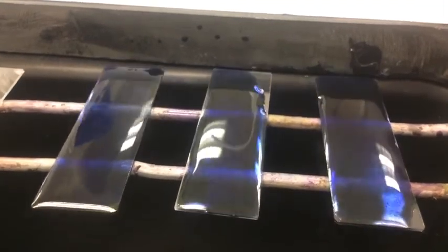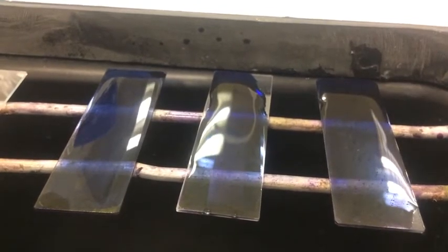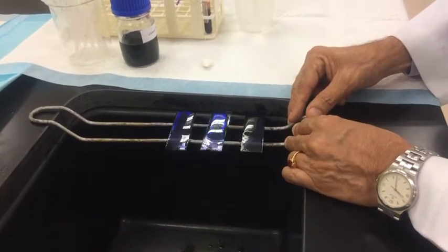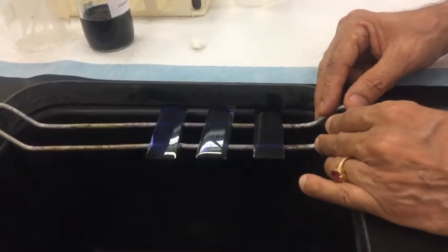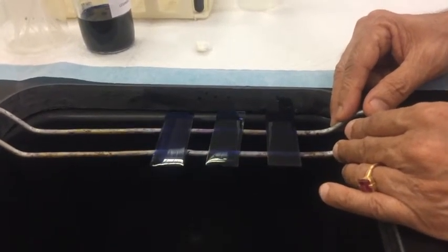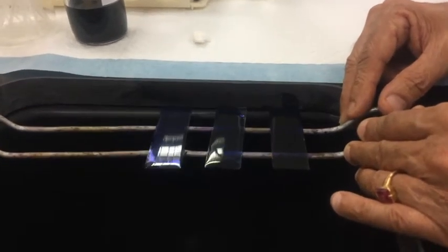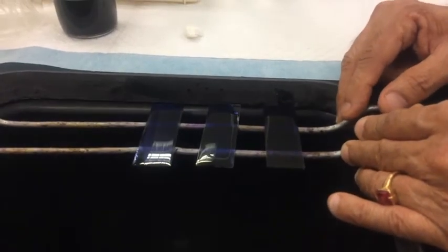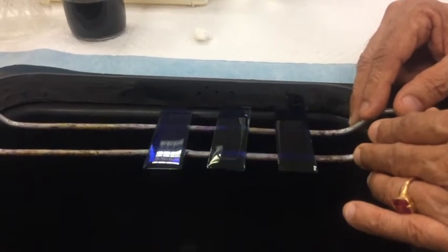Leave it for about ten to twelve minutes. The reason for rocking the slides is to prevent scum particles from sticking onto the slide, which would produce black dots when observing the cells — these should not be mistaken for stained granules.